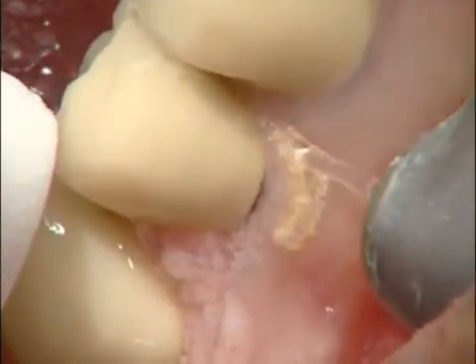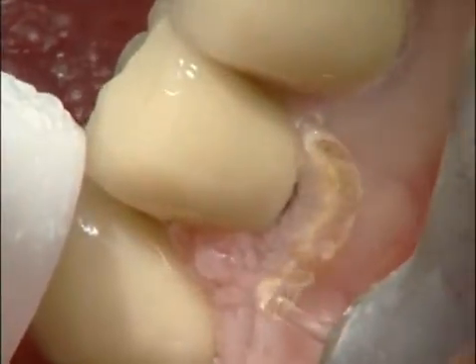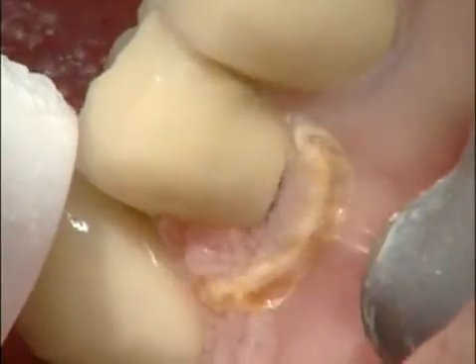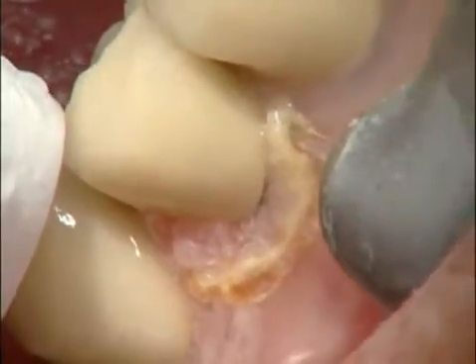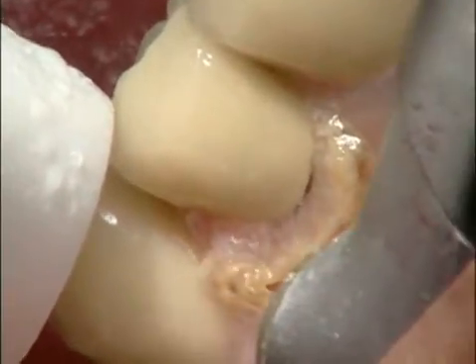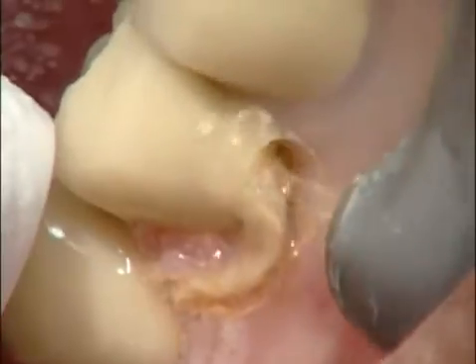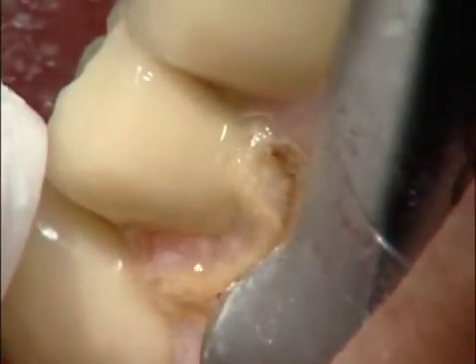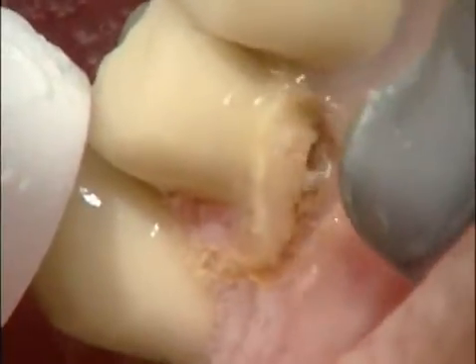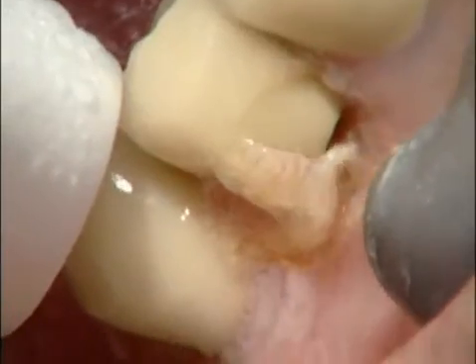Here we have a gingivectomy, gingival contouring on a keratotic hyperplastic tissue patient. Besides having this tissue that's difficult to deal with, this lady is severely medically compromised. She has a heart condition where she can't have most local anesthetics. She's also on Coumadin, so I haven't taken her off of her Coumadin. And I'm doing this without anesthetic.